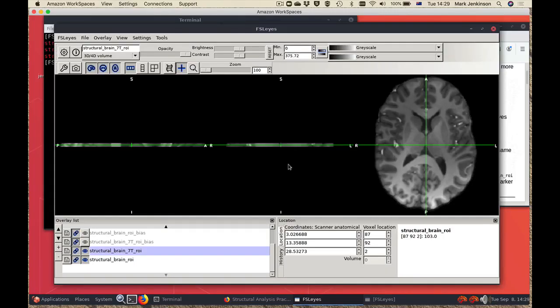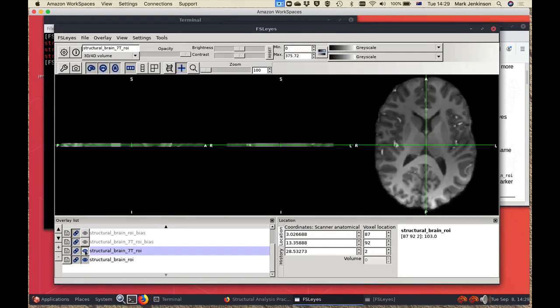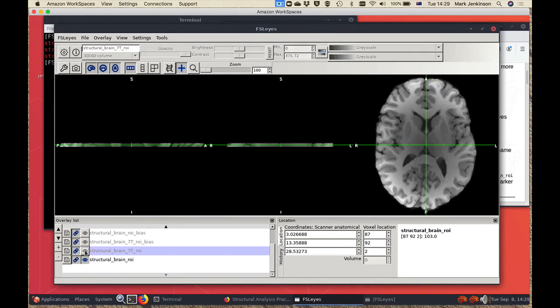If I load these images into FSLeyes they look like this. It's a very small number of slices but each axial slice is in full. This is what the 7T image looks like and this is what the original one looks like. Crucially, if I flick backwards and forwards you can see that the anatomies are the same but the bias field is very different.